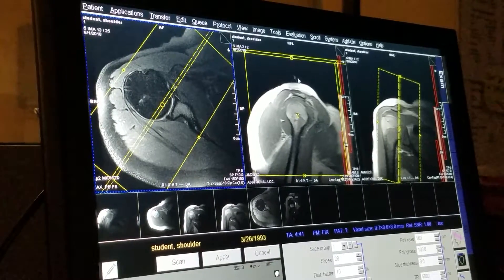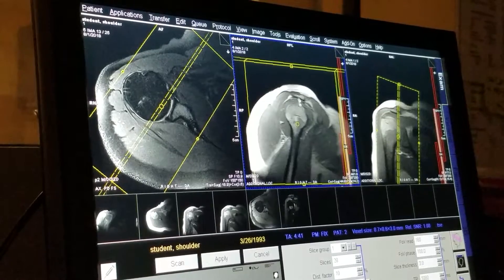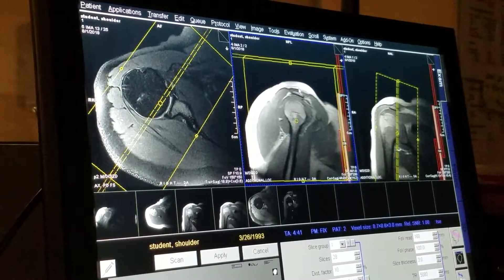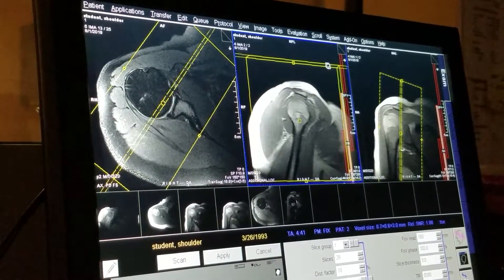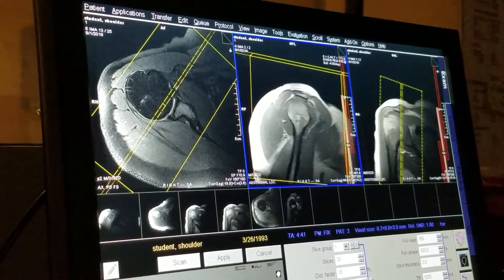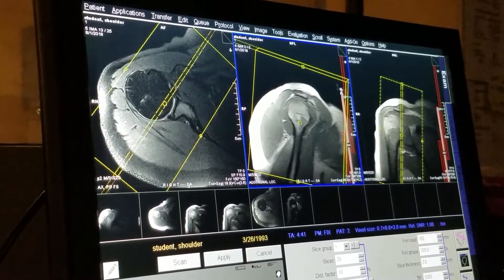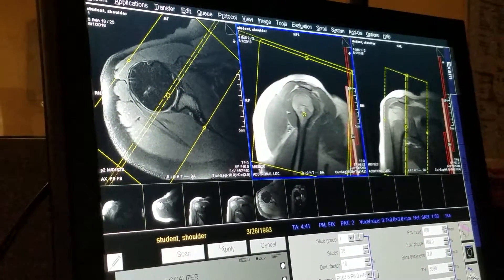On your sagittal localizer, you can bring your field of view down a tiny bit. You want to make sure that, depending on the size of the field of view, you always include the superior part of the shoulder. And if you want to angle your field of view so that the image comes up upright and straight, you can. And then we're going to apply that.